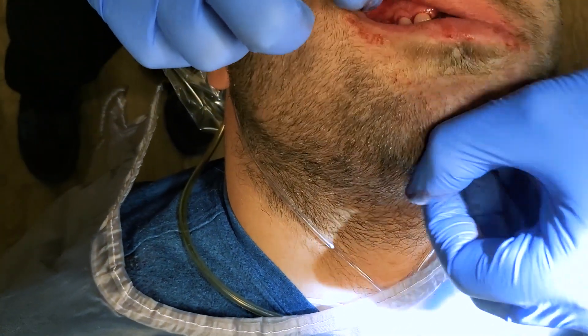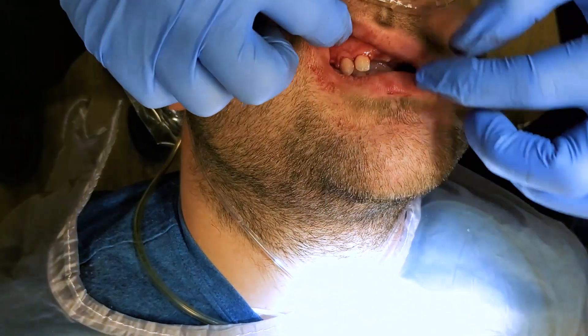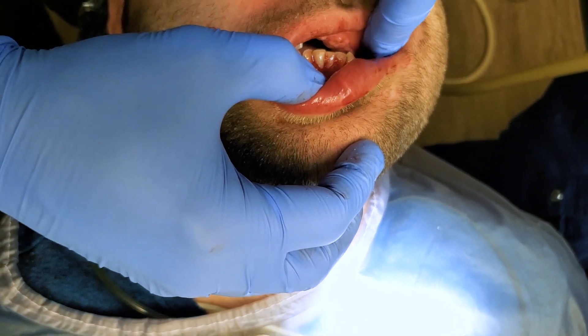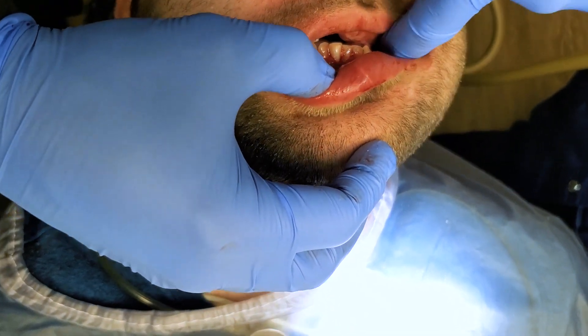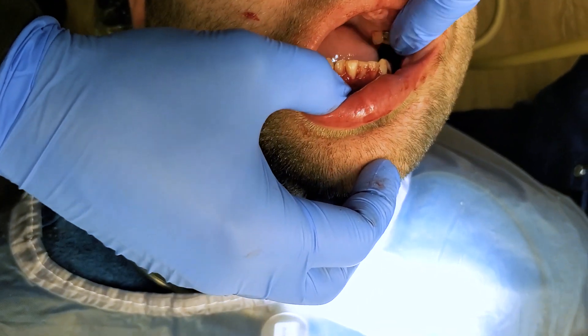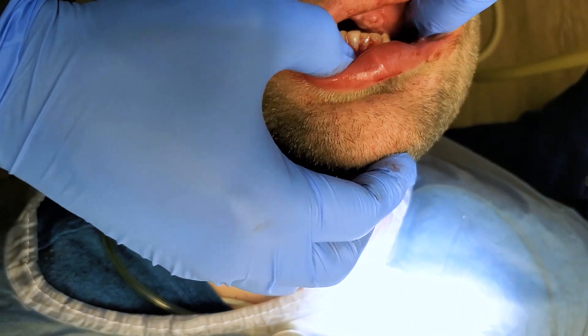You can get a feel for the occlusion — how the teeth come together right here. Over here is the edentulous area. You can see there's a lot of bone here. I used bone morphogenic protein to help regrow the bone in this area. Open nice and big for me again. There's one tooth that needs some dental work — go ahead and bite down for me.